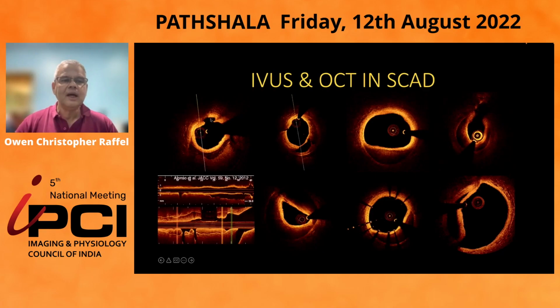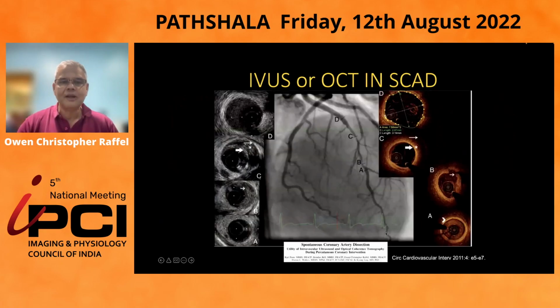Here you can see an intimal tear, the typical intramural hematoma, a bit of contrast is leaked in here. Here, a nice picture of the intimal medial membrane with the intramural hematoma. Here, the false lumen is compressing the true lumen. And even with stenting, particularly with OCT, you can see the appearances really very nicely.